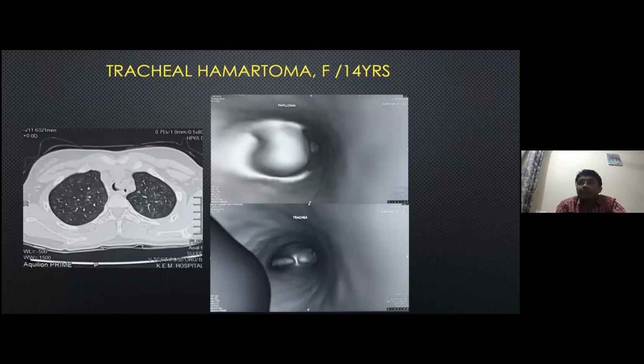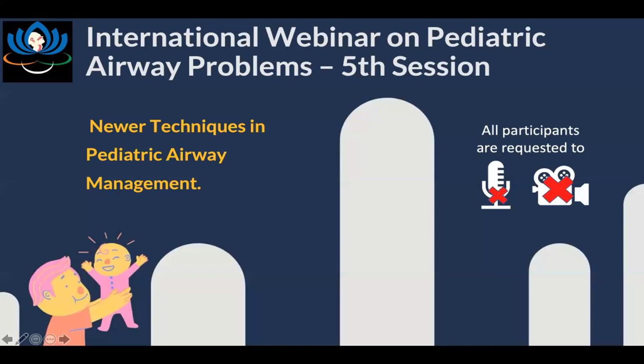Okay. So great work, Arpit, I must say. Thank you. When we started doing grade 3 and grade 4 stenosis, we were very excited because you will get a few cases with grade 3 or grade 4 which are going to respond very well. But over the long term, our study showed that grade 1 and grade 2 is the perfect stenosis for coblation. And you will get failures. We learned to underdo rather than overdo.